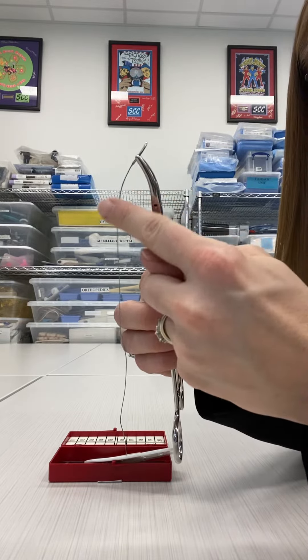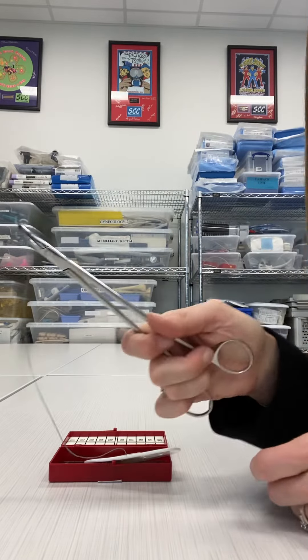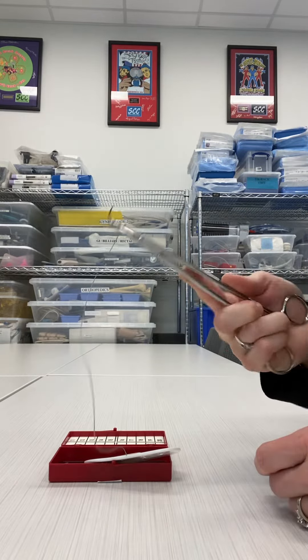You can see the curve is away, but the tip is still this direction. That way, if I have it in my right hand, I am ready to take a stitch with it.